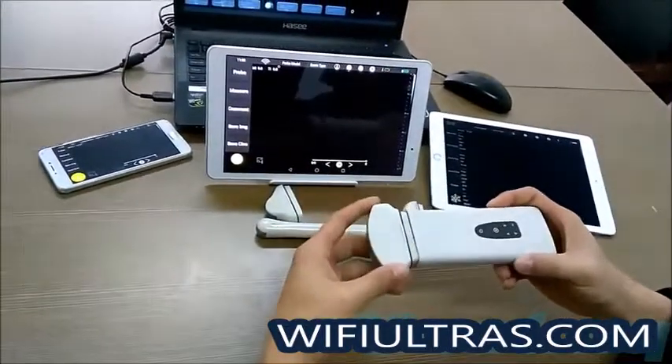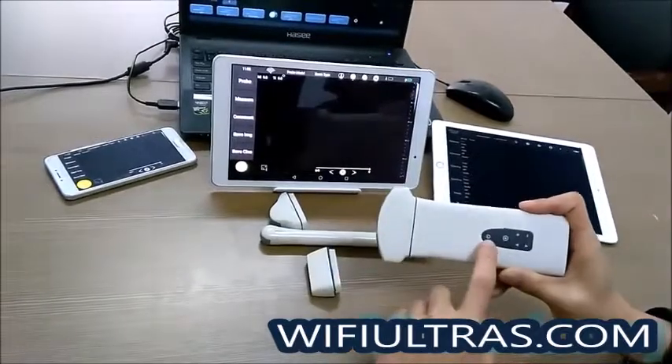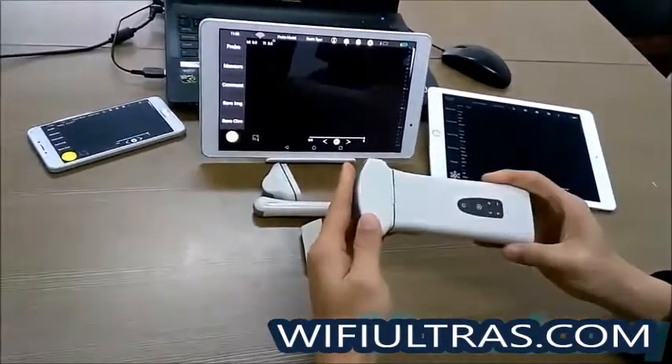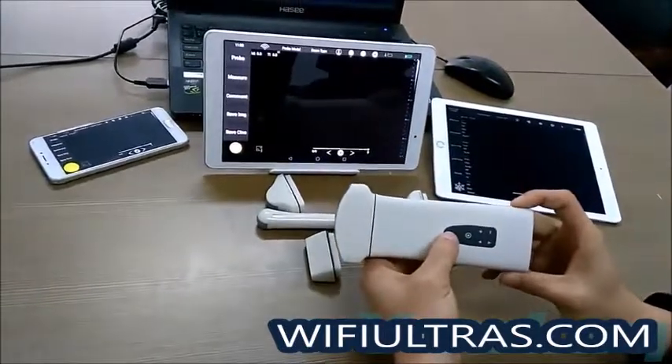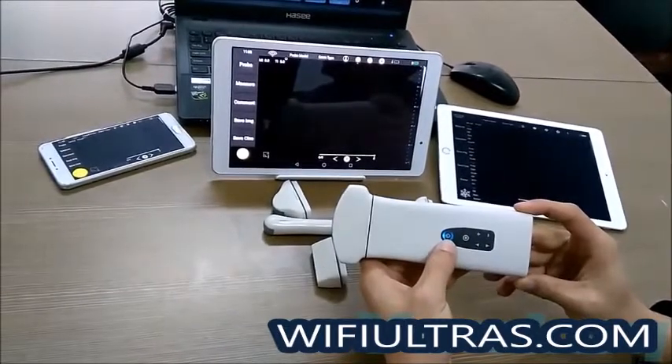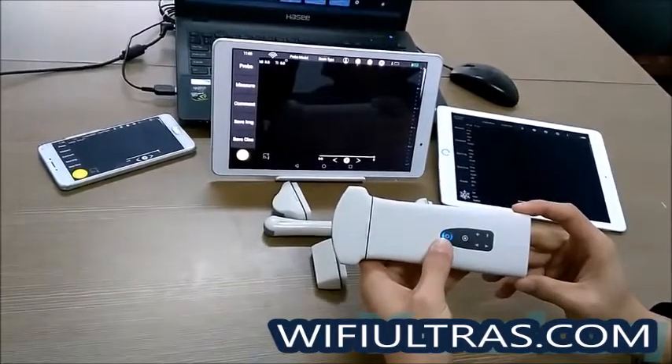Please make sure the system is powered off or frozen before changing probes. To boot it up, press the power button and the system will be turned on.